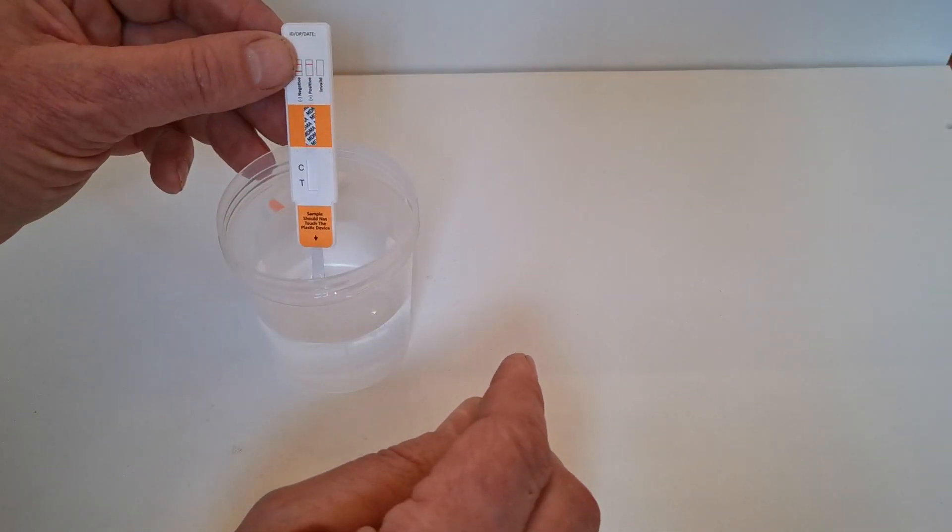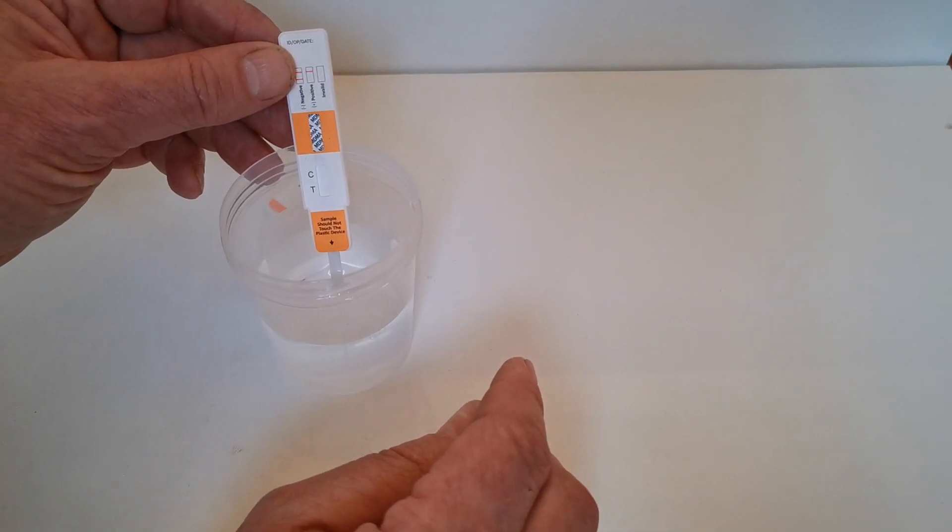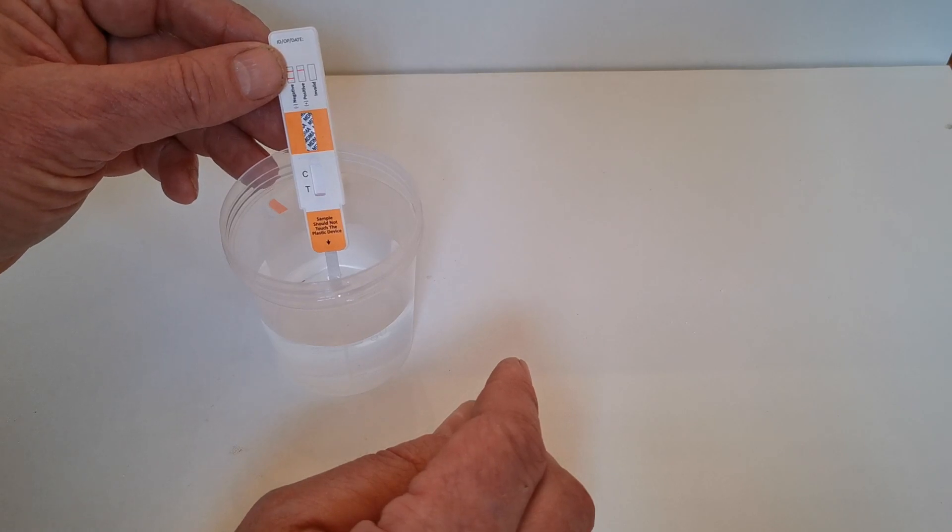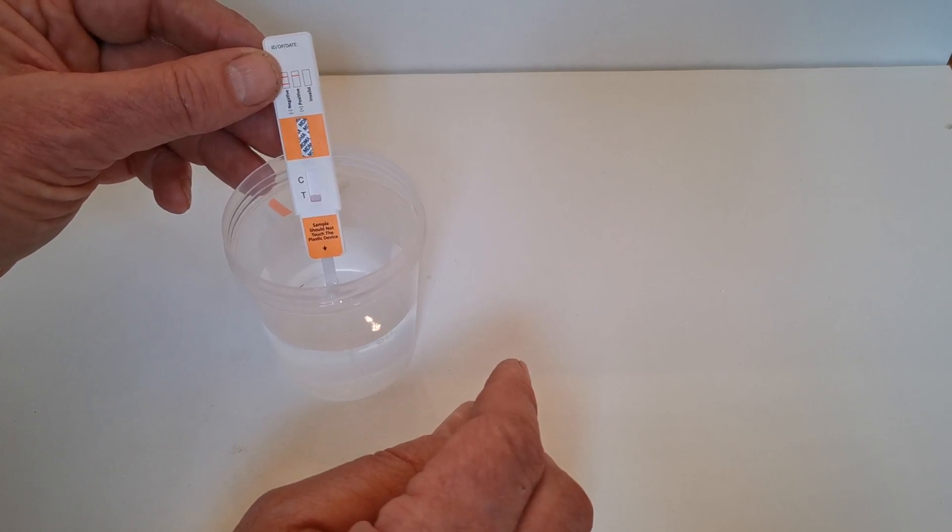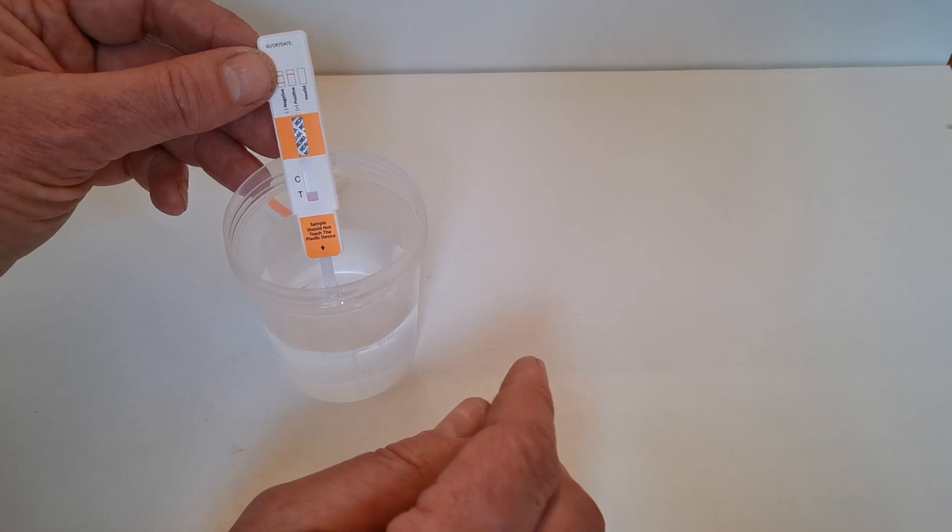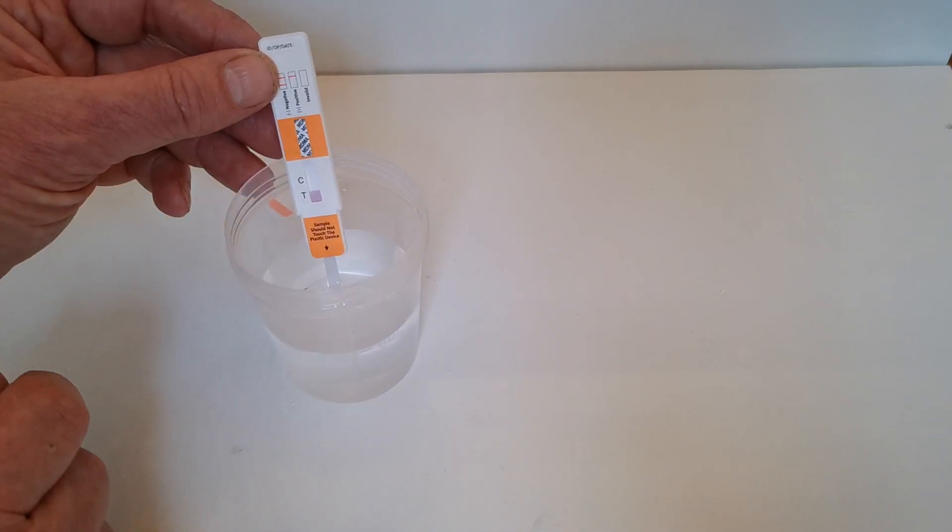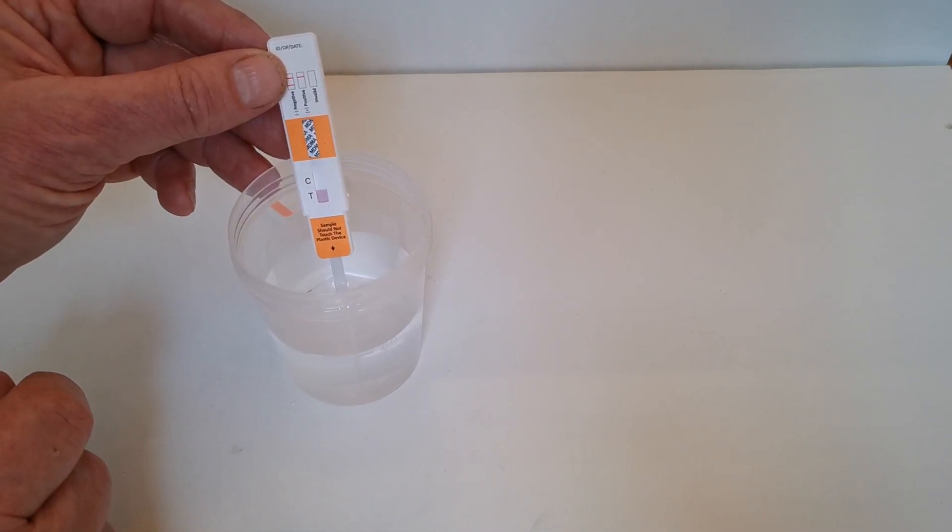Just dip it to below the level of the panel itself. It gives an indicator on that test and you need to leave it in the liquid if you're going to dip it for probably between five to ten seconds. And you can see that pink dye starting to run up in the results window here, indicating that it's absorbing that fluid.